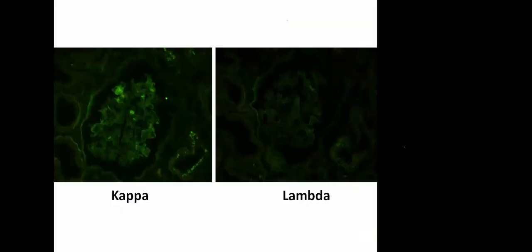Whenever you find these kinds of randomly arranged fibrils, the first suspicion should be whether I'm dealing with some amyloid deposition. And because the morphology was normal, early amyloid may be missed on routine microscopy, because early amyloid will be picked up only on electron microscopy. So we did paraffin immunofluorescence because these slides were reported outside as minimal change disease, but the patient did not respond to therapy. A stage came when the nephrologist thought whether we should give rituximab, but they thought let's review this case before we give rituximab.